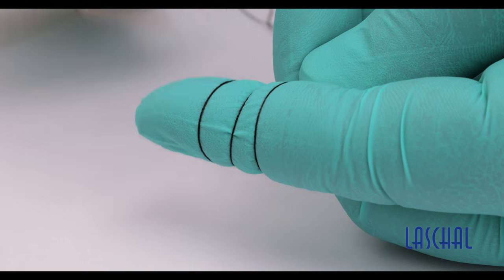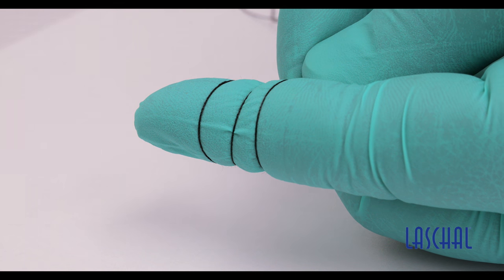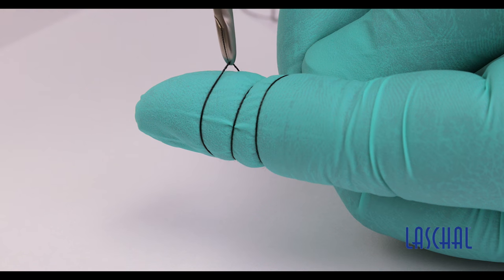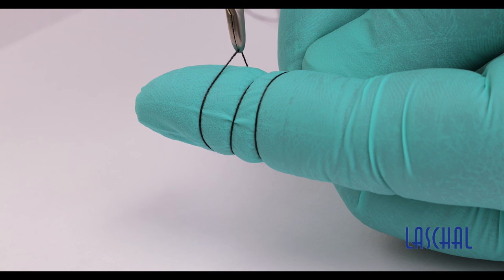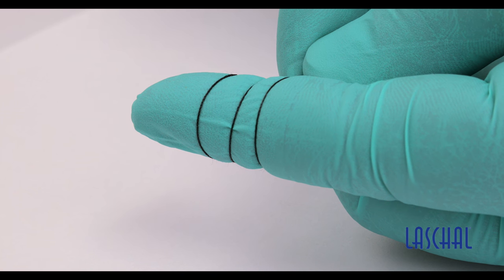The traditional means of removing a suture is to either sneak a pair of scissors underneath or to use forceps to lift and create some space so that a pair of scissors can be fit to cut the suture.